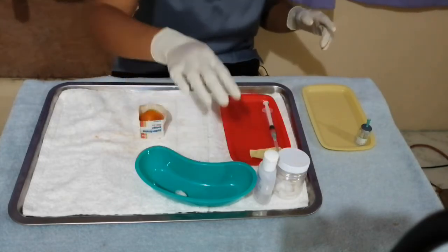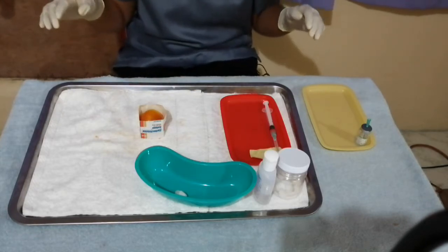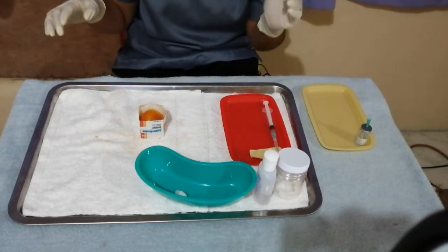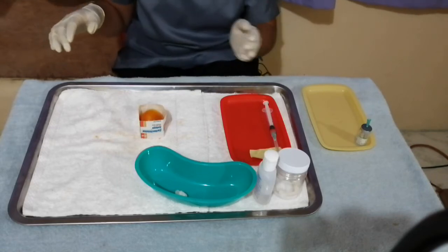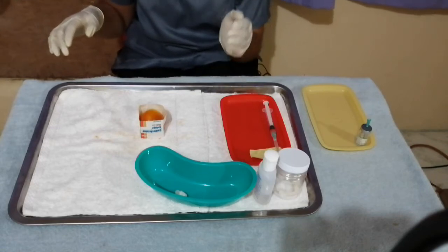Then dispose, then gently but firmly use our non-dominant hand to pull the skin in one direction away from the site of the injection.